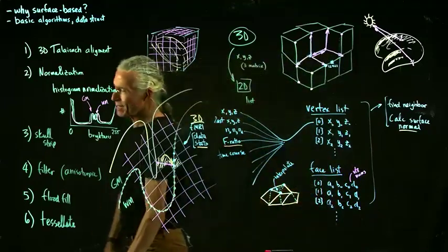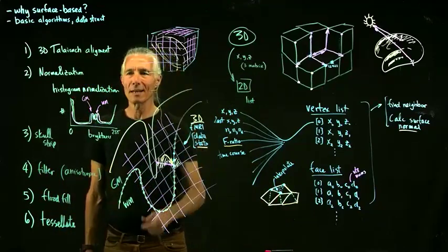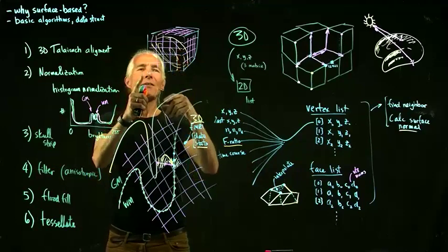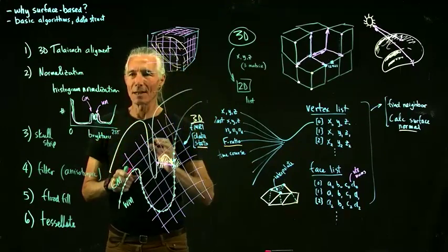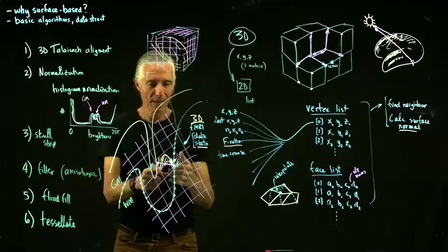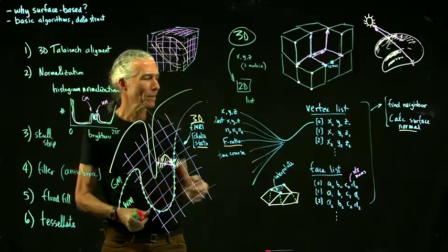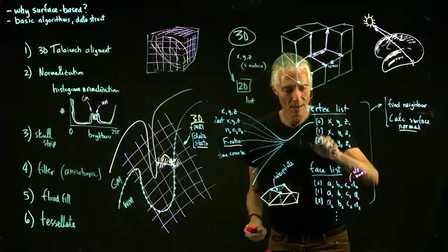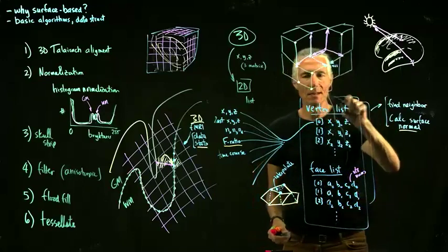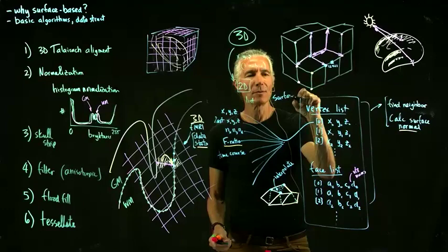So you can see it's a bit of a pain in the butt compared to 3D. In 3D, you just did your analysis. You say this is gray matter, XYZ, and this is stats, XYZ, you're all done. Here we've got this more complicated thing where we've got to sample the data onto the surface, and you're dealing with a list. So this thing here is your surface specification. You're dealing with a list rather than a simple 3D matrix.